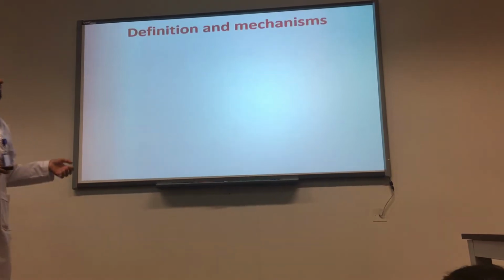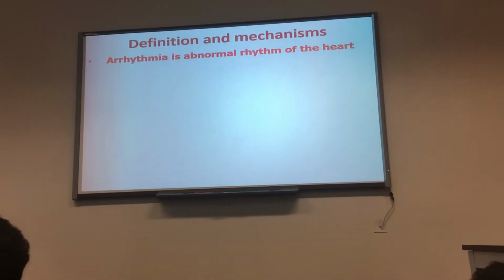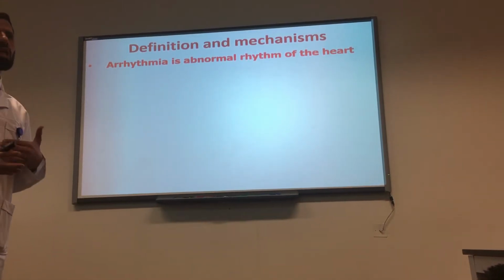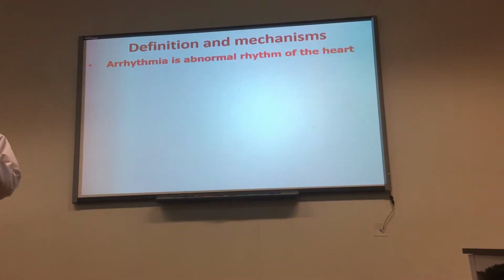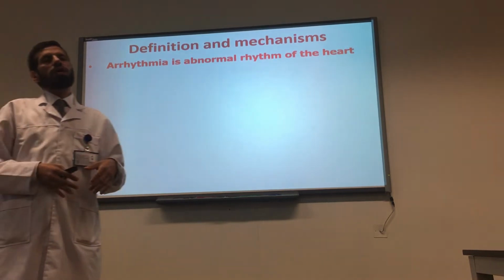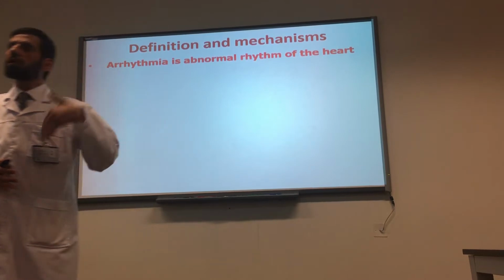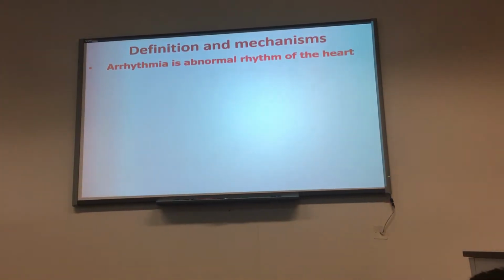Okay. So to know what is abnormal heart rhythm, we should know what is the normal rhythm. So what is the normal rhythm? Sinus. Okay. And what is additional to that? 60 to 100 under resting situation. So normal sinus rhythm is sinus and 60 to 100. Okay. If it is above that, what do we call it? More than 100? Tachycardia. Below it? Bradycardia.